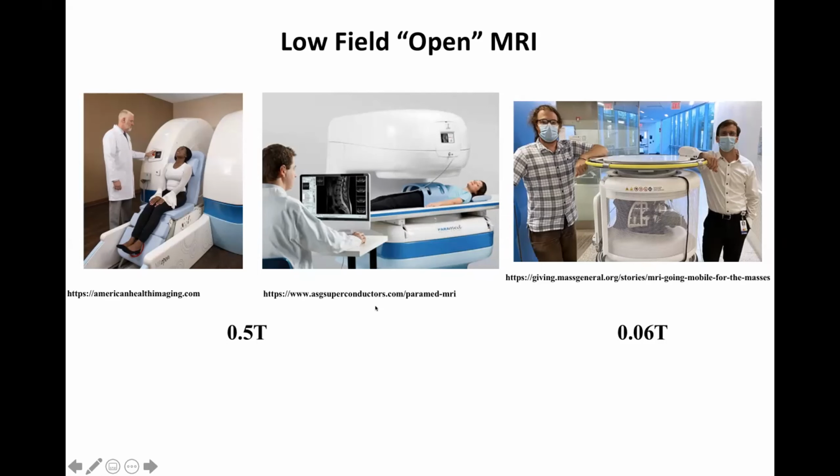You can look it up on this website, but it's interesting that there's a new superconducting material that's used to create the windings in the magnet, and so you can get a half a Tesla between these two poles. There's quite a lot of force at that point between these two poles that want to pull together. So you have a very strong magnet.